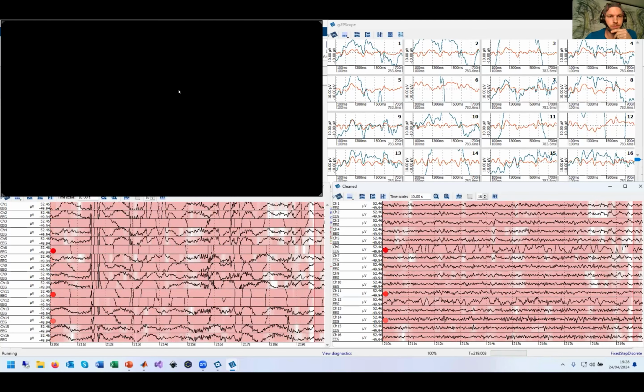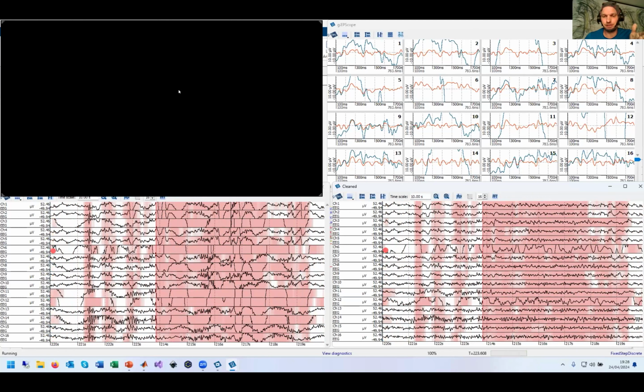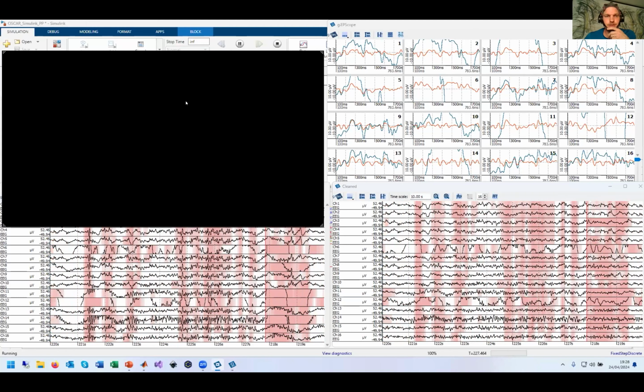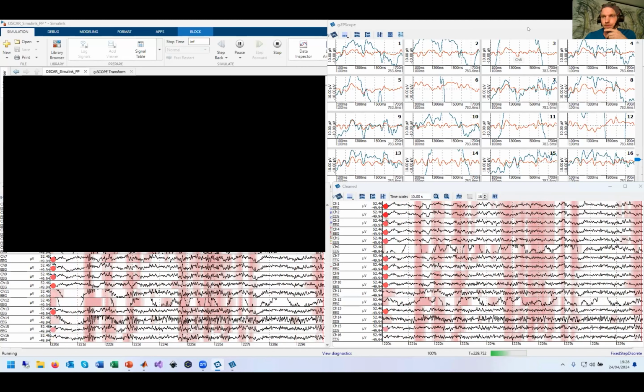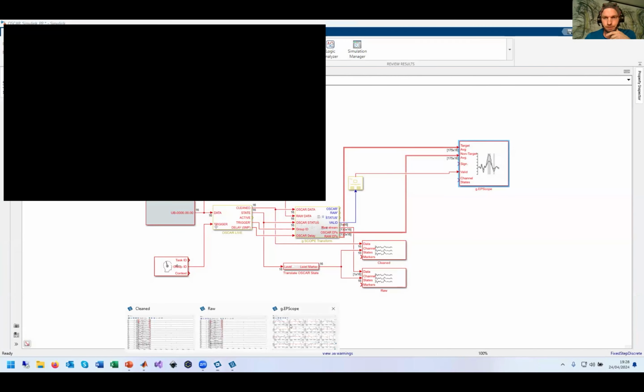It's finishing soon. Oh, no. That's a good internal clock I have. Yes. Stop the model and discuss the results a little bit.